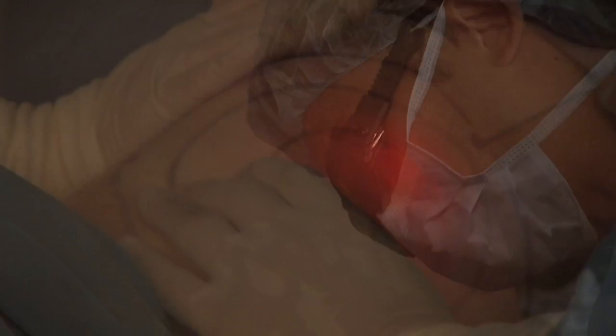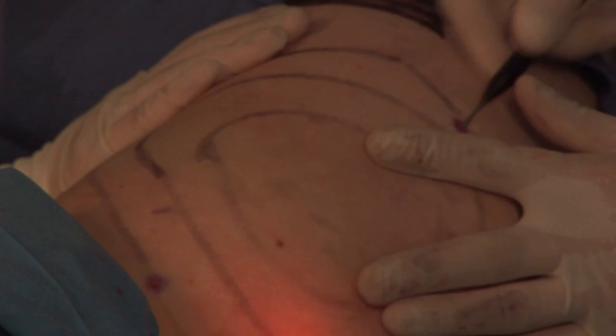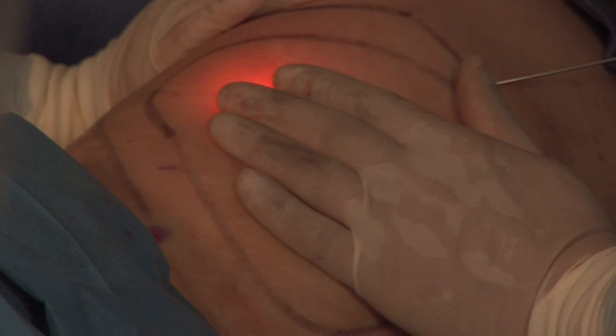So now we've done the subdermal plane, and I'm going to use another 4000 joules to get into the fatty layer. So I'm going deeper now. You may or may not be able to tell that the laser aiming beam underneath is not quite as bright, because I'm in a deeper plane. The tendency is to move a little too quick, but you actually need to slow down and let the laser do the work. So right now all we're doing is melting the fat.